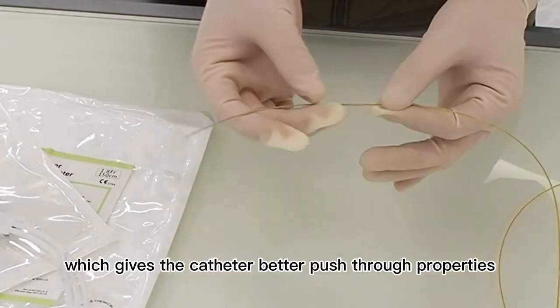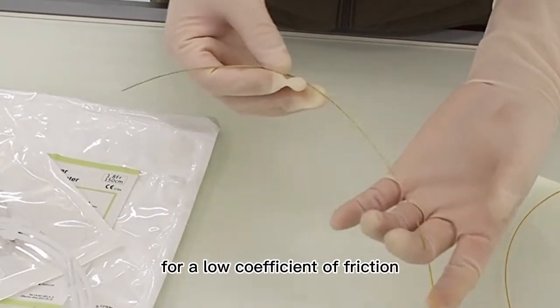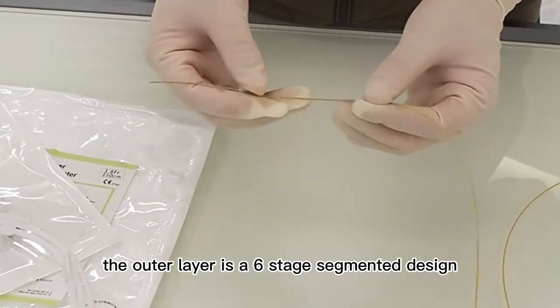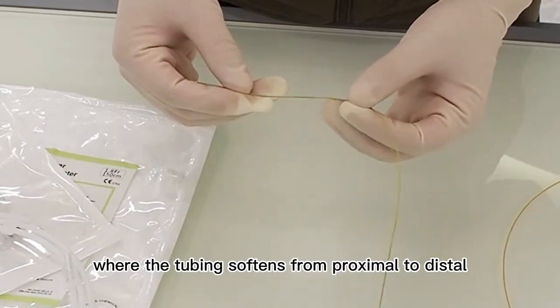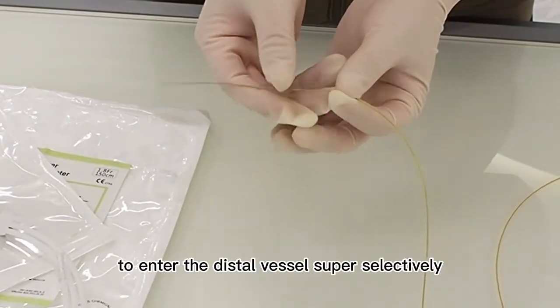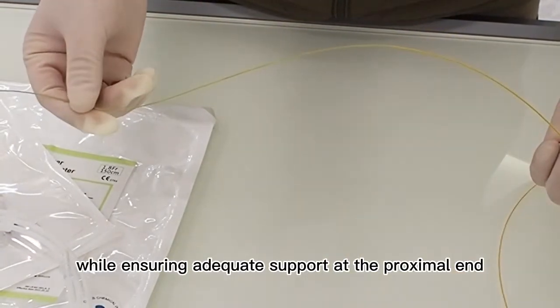This gives the catheter better push-through properties. The inner layer is made of PTFE for a low coefficient of friction. The outer layer is a six-stage segmented design where the tubing softens from proximal to distal, allowing the soft distal end to allow the microcatheter to enter the distal vessel super-selectively while ensuring adequate support at the proximal end.